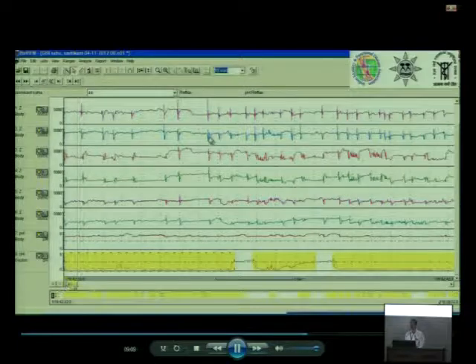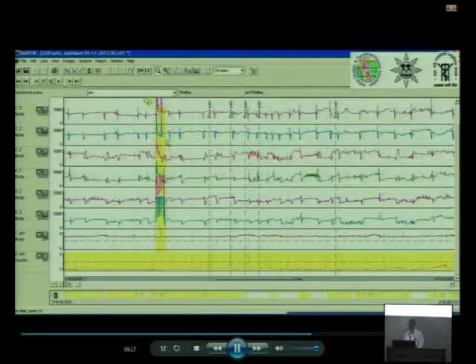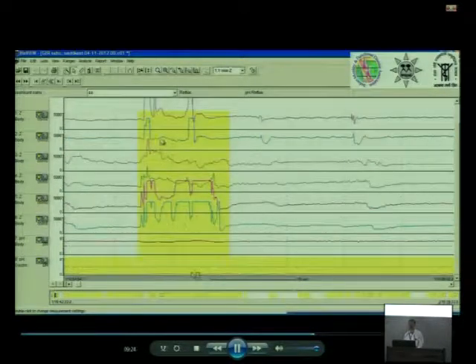So when you want to scan, what you do is make this, which we said is 10 minutes, and scan one by one. Look at this. Already the system has given a yellow mark over here and says there is an abnormality here. We know what the abnormality is. This is gas. Look at that, the impedance value has gone up.